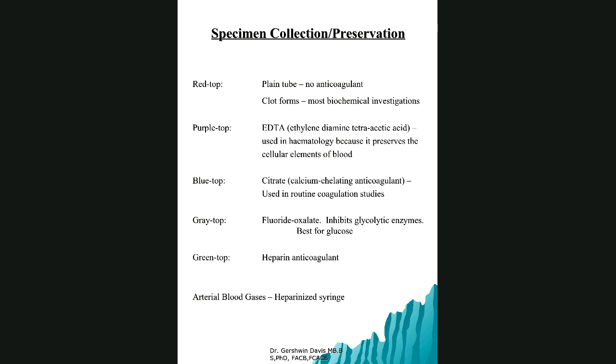Green top is usually heparin, and as I mentioned, blood gases. Sometimes you get a little blue top coming in there, so be careful. The added point about this green top tube is, please do a little more research. They may be light green or deep green. Which one is lithium heparin and which one is sodium heparin? Green in general can be lithium heparin or sodium heparin, but please know the difference.